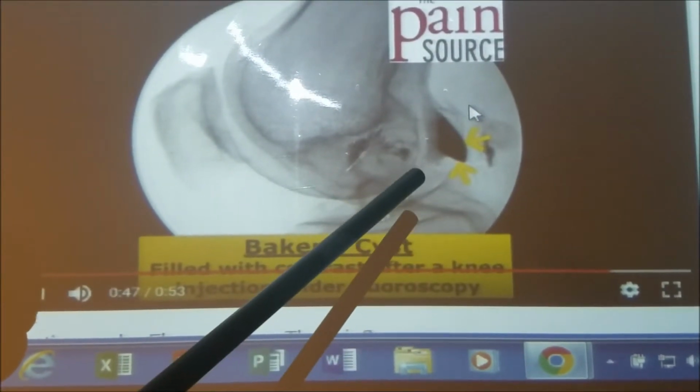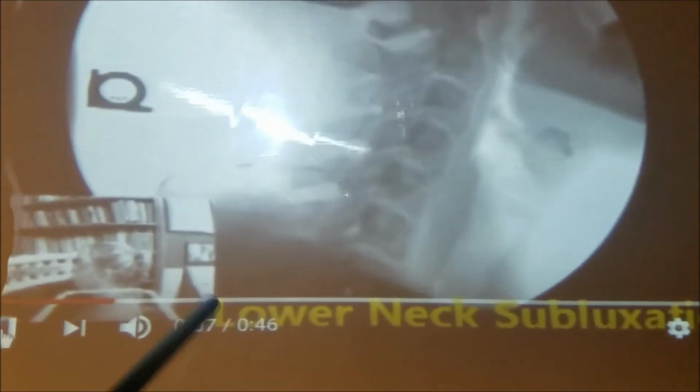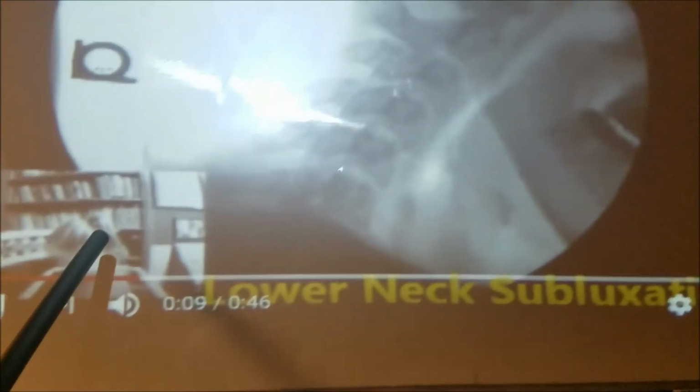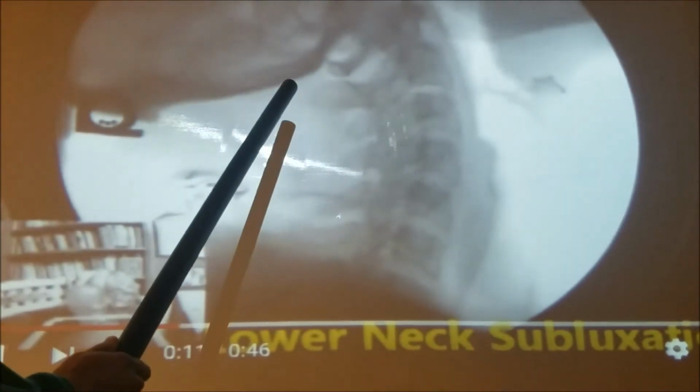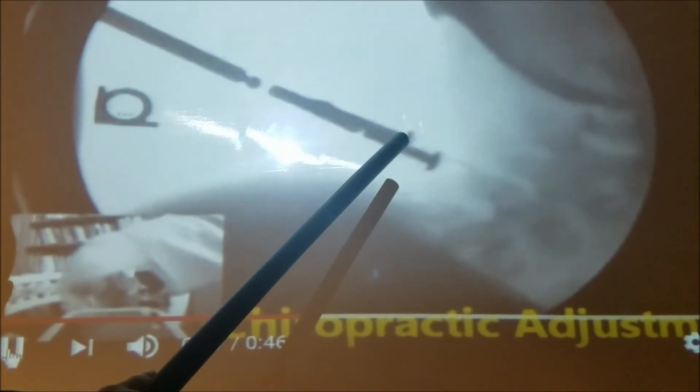As you could see. Another clinical application is the cervical spine during fluoroscopy. Here is an example of a woman during fluoroscopy procedure. Look at the flexion and extension of the cervical spine looking for any trauma. Look at the quality of the image in motion without blur.